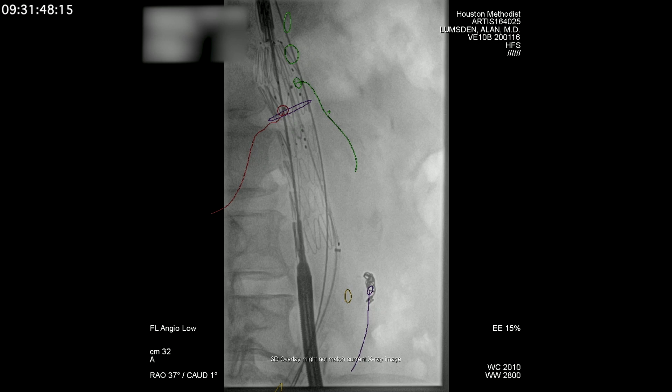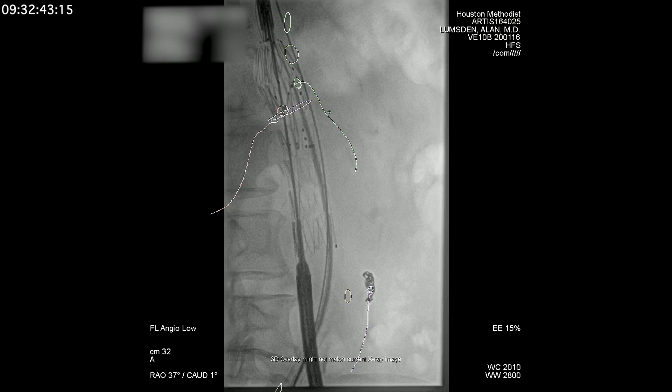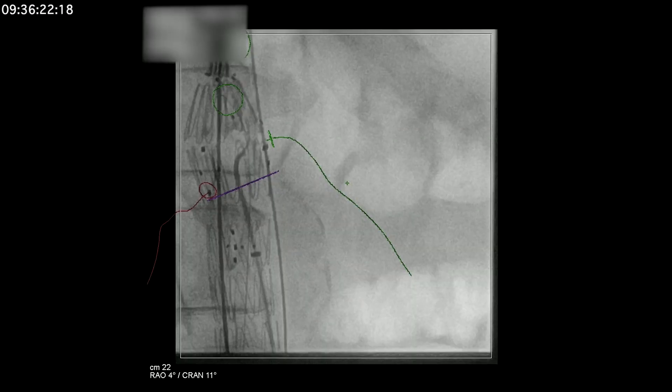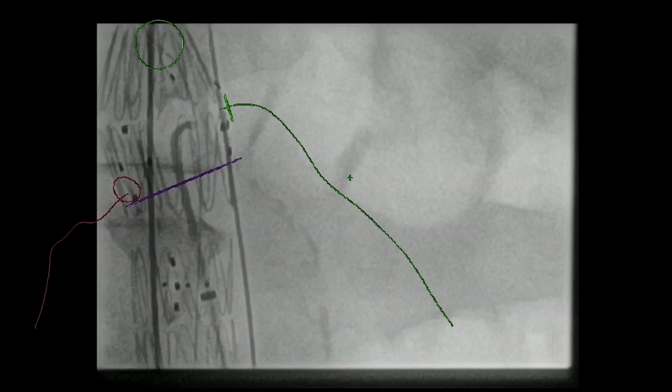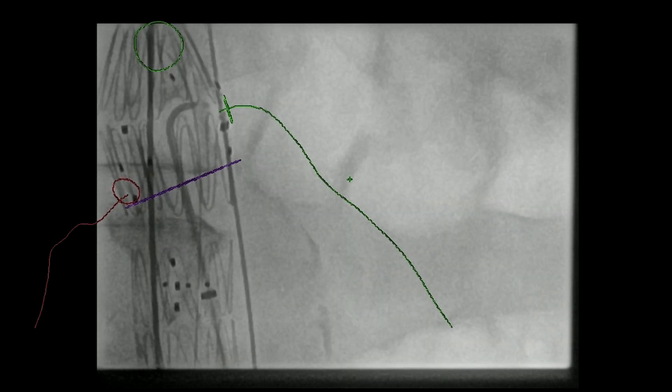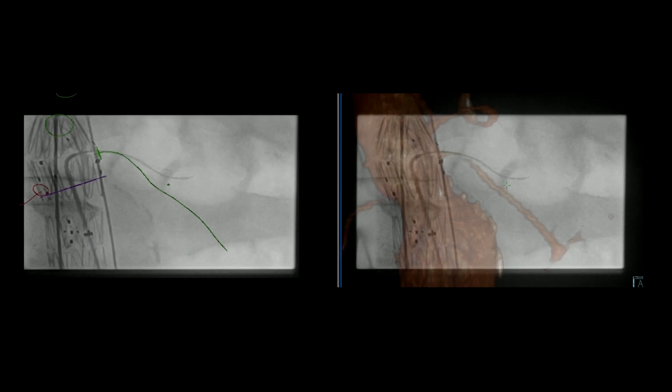Next is to puncture the diaphragm of the fen and bring up sheaths. These are Ansel sheaths brought up into position, and you've got to ensure that the wire is inside the fen. You can deflect it off the top of the fenestrated component — make sure you're not outside it. Two sheaths are placed up inside the fenestrated component so you can wire both the right and left renal arteries. We then switch to a catheter to select the origin. You want to get that wire through the fenestration and down the left renal artery. Looking at the center line of the left renal artery and the orifice, it looks well aligned.